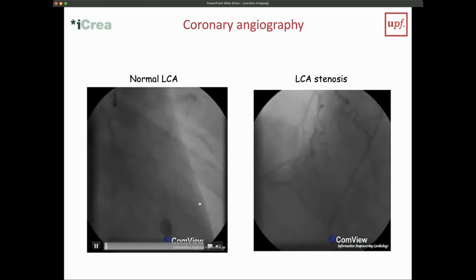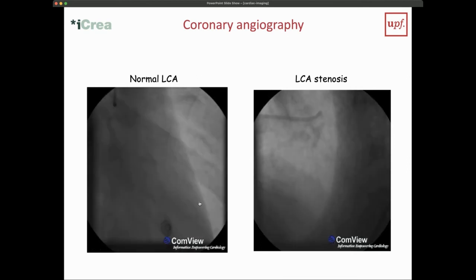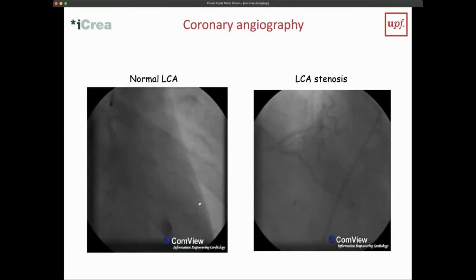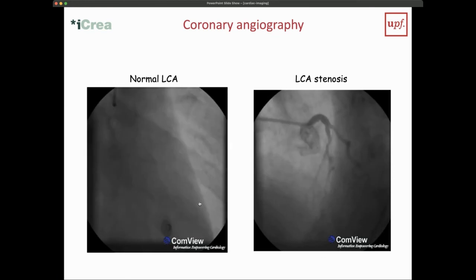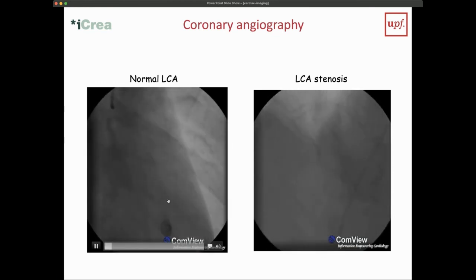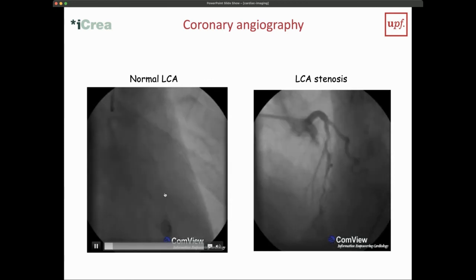So what you see is this overall motion of the heart is actually the operator, who has chosen as small a region of interest as possible in order to limit the radiation, but then moves the whole tube during the imaging in order to cover everything. So you see that this is actually something which seems to be stuck to the body. It moves at the same speed as the ribs.